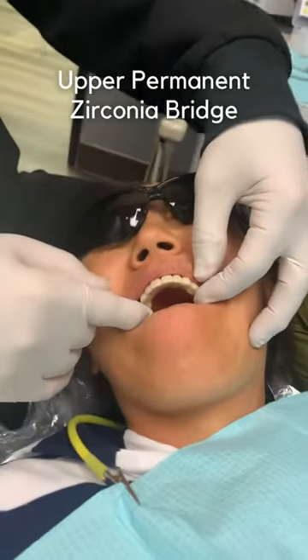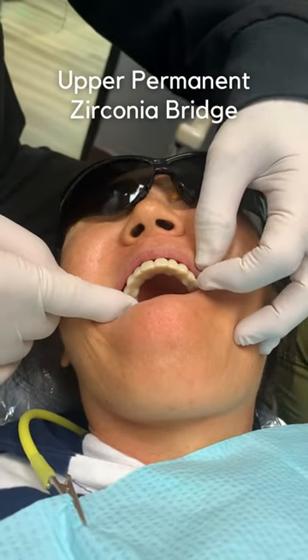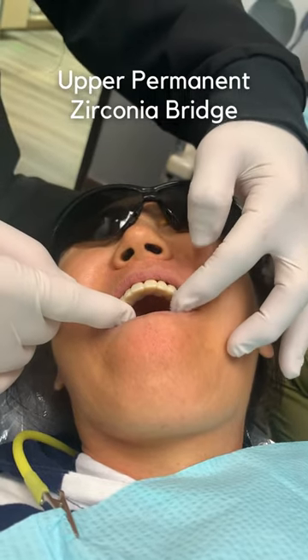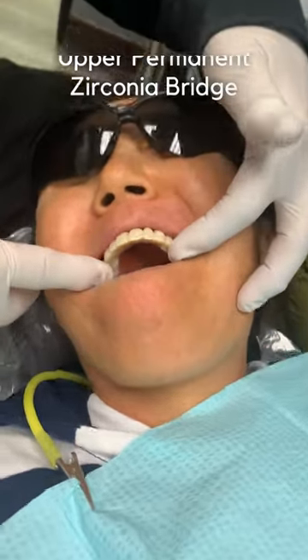This is a very exciting day here for Janet. We just installed the upper permanent zirconia teeth and soon we'll have to just finish the loaders and it's all going to be done.